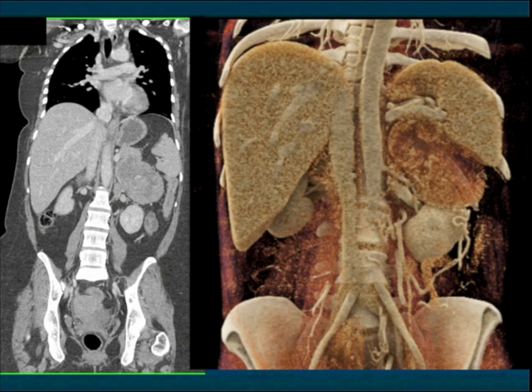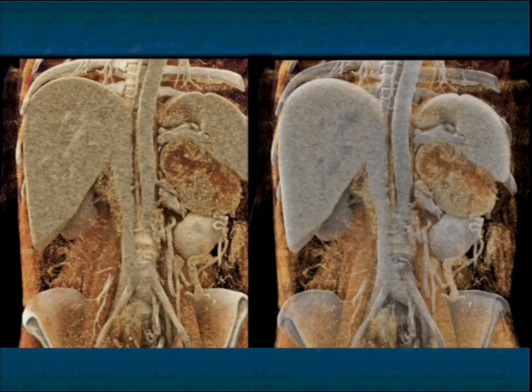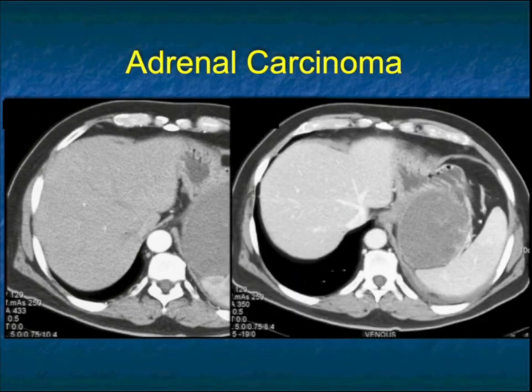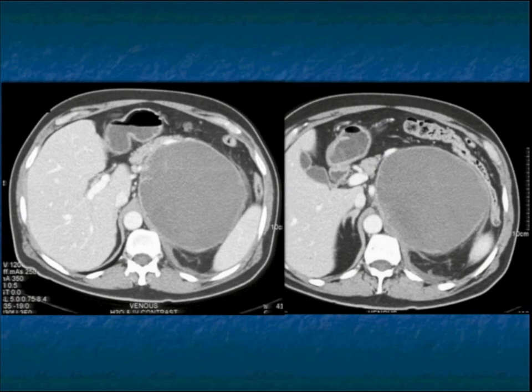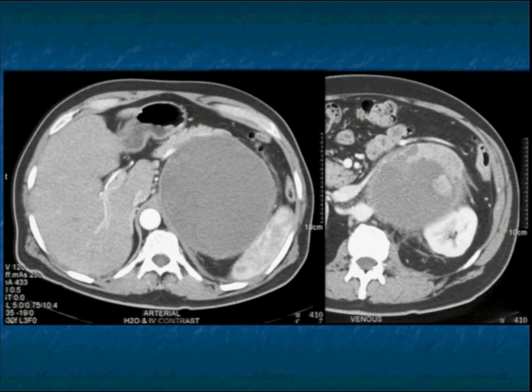Again, just to show you an example with the coronals and the cinematic. Again, the central necrosis. In this case, what looks like a well-defined capsule. And you can see as I change the rendering parameters, we can really bring out that information and show it very nicely. One thing to also comment, adrenal cortical carcinomas can sometimes be very cystic. Here you can think about a cyst or old hemorrhage. When you go down, the wall is somewhat enhancing, it's definable, and you look hard on the lower portions, you see more solid components. So you knew it had to be a malignancy.